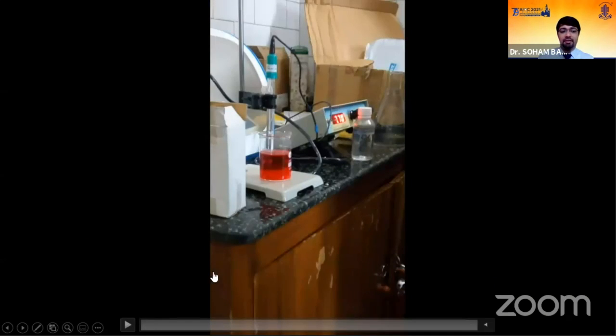Next, we prepared the base solution, mixing the DMEM in a 1:1 ratio of water and glycerin. And we also use sodium bicarbonate. This is to be maintained at a pH of 7.8 plus or minus 0.05. The pH is adjusted by using sodium hydroxide and HCl. This is connected to the pH meter and we adjust the pH till we have a satisfactory reading.